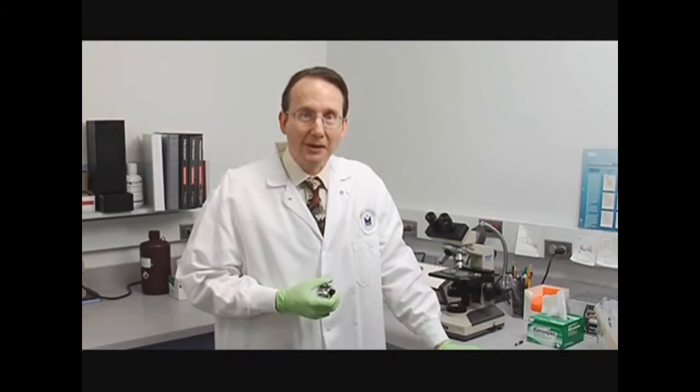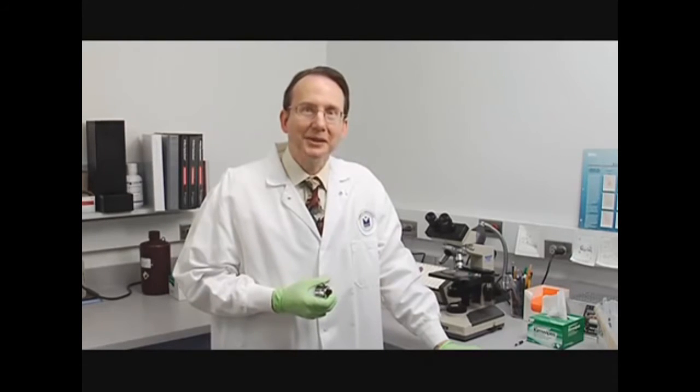After completing the tally on each side of the hemocytometer, make sure you note your results on a lab report form or log sheet. That concludes the demonstration of the manual platelet count.